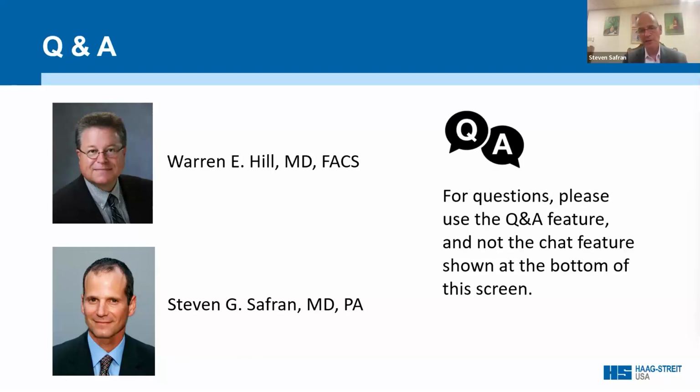But when you're looking at the garden variety patient, you're going to put a toric lens in. Usually there's about a half diopter of posterior cornea astigmatism that contributes to against the rule. That's usually about what you're going to see, what you're going to get. And Barrett sort of fudges that based on his algorithms, which are actually very good, very accurate.